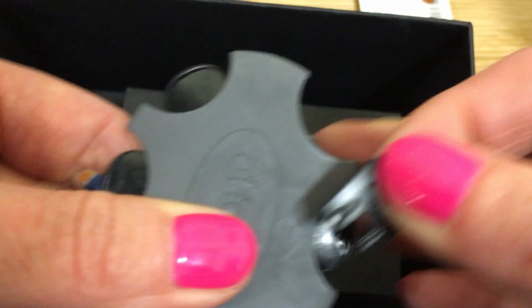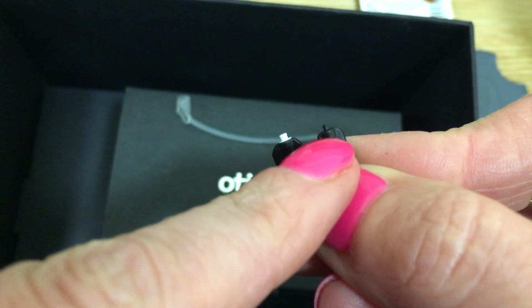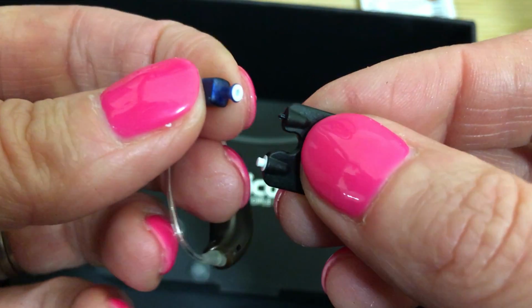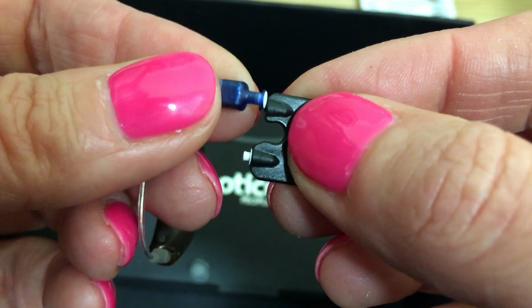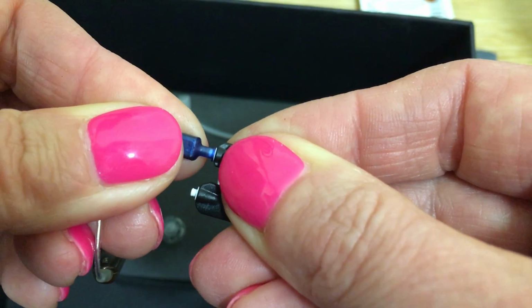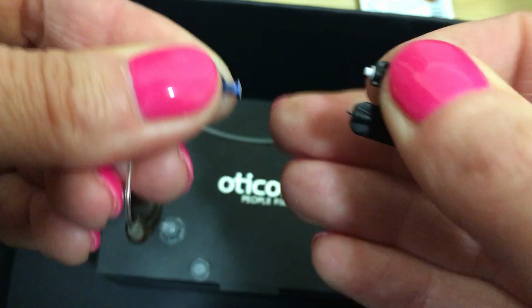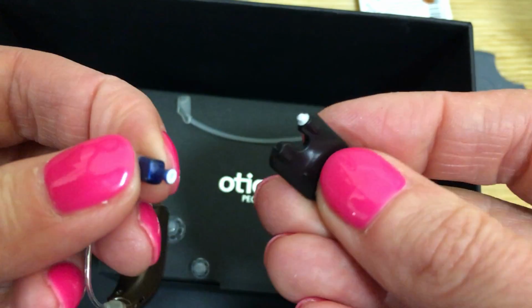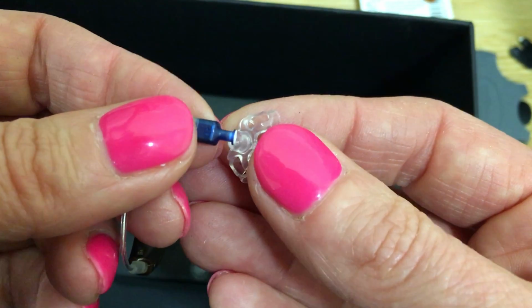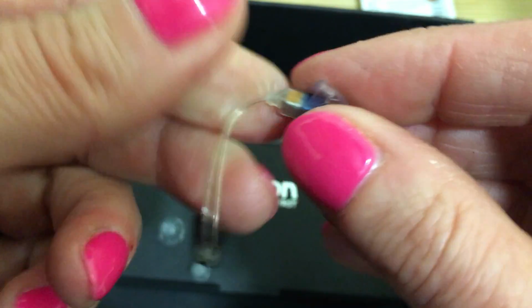We remove one of the units. The little tool has an end to remove the old filter, and this end is the fresh filter. So we use the little tool to click in. That will click into the used filter, remove it. We then push the fresh filter in and dispose of this. It's important not to get the used filters mixed up with the fresh filters. We then replace the dome and the instrument is ready for use.